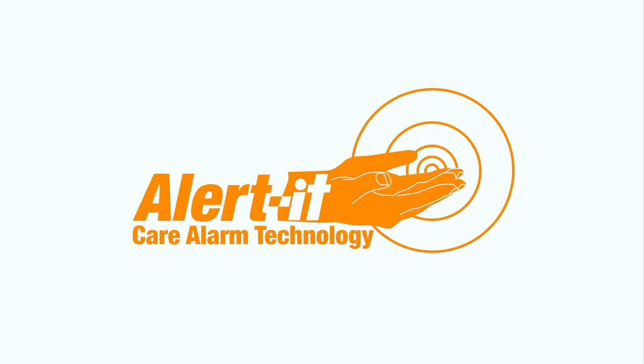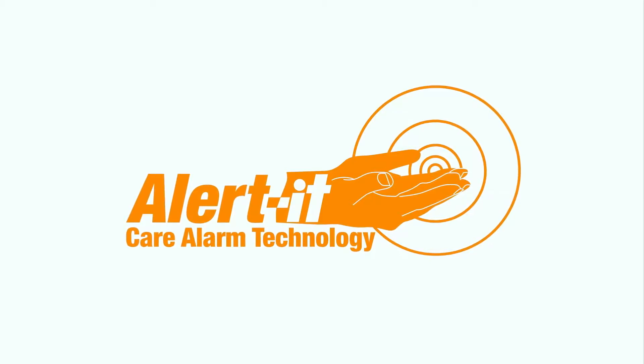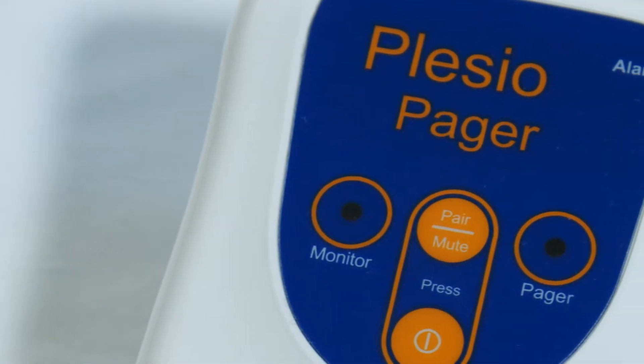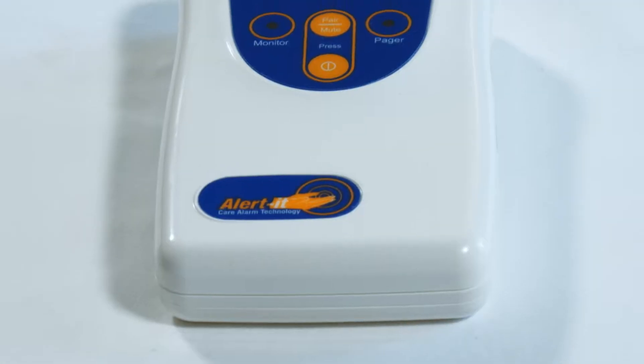Alertit are a forward-thinking manufacturer specialising in design, production, distribution and support of care alarm systems. Our latest product, the Companion Mini, has been designed to provide peace of mind by discreetly monitoring an individual to detect prolonged abnormal movements associated with epilepsy.